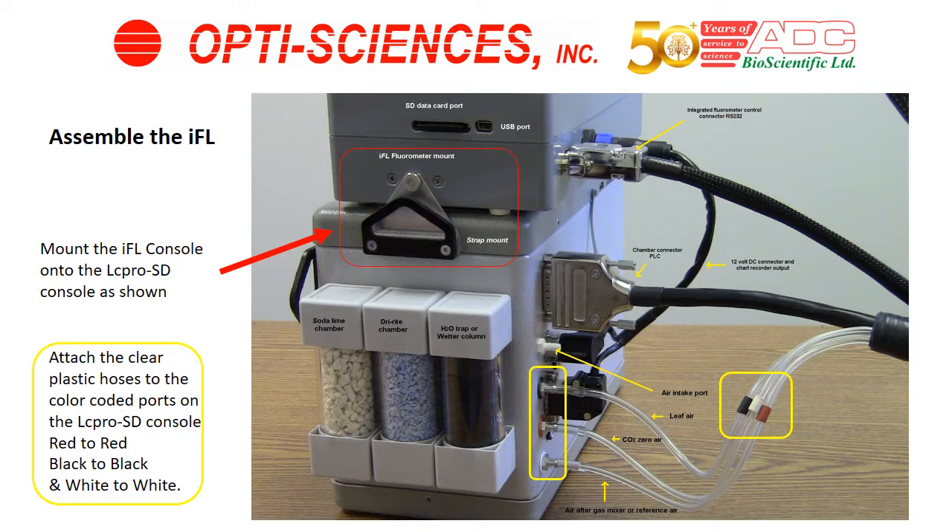Next, attach the clear plastic hoses to the LC-PRO console, as you see in yellow. You're going to match the colors on the clear tubes to the colors on the console: black to black, red to red, and white to white.